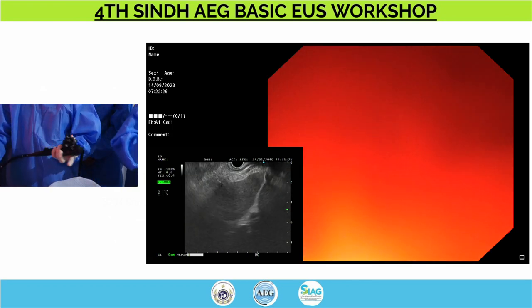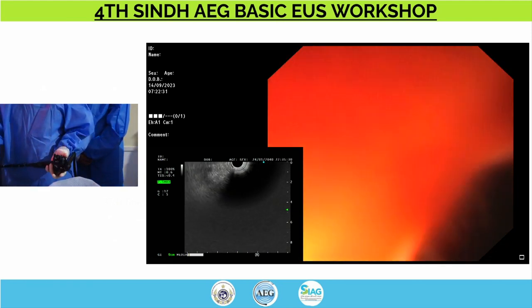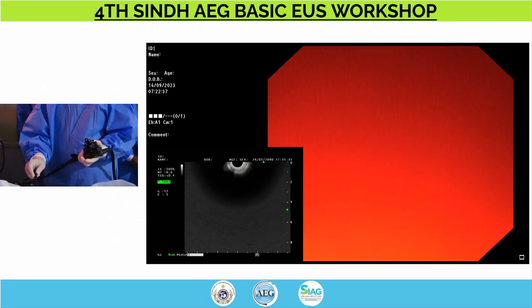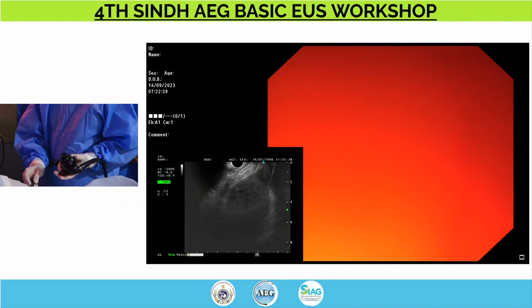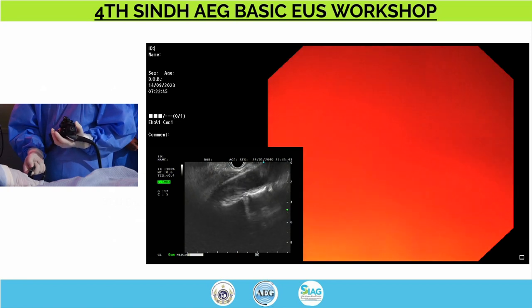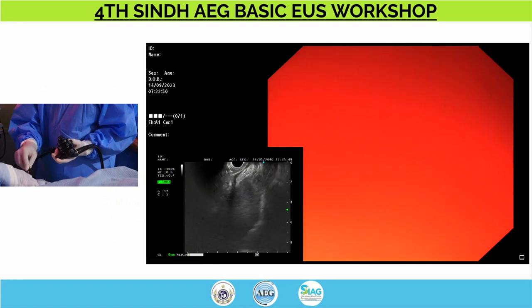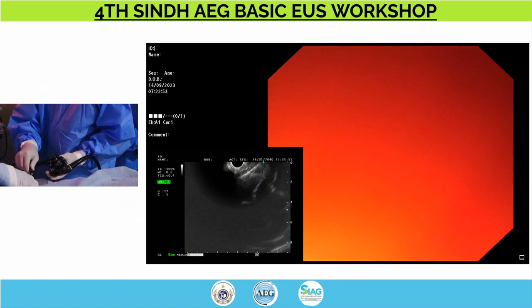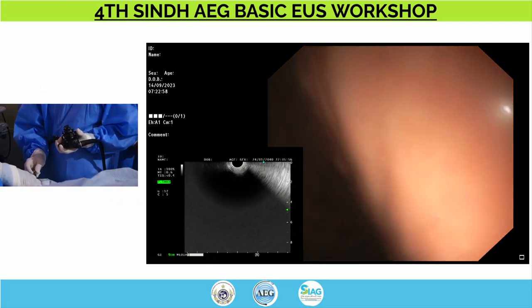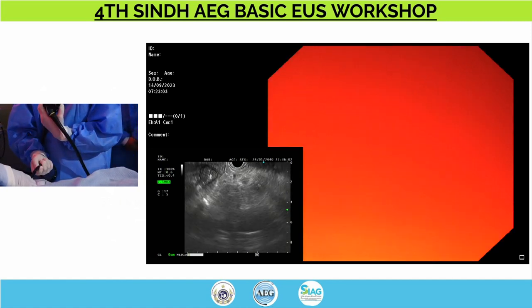So it's interesting. We're looking at this area that appears somewhat indurated, and this is just below the EG junction, and it doesn't appear to be corresponding to a mass-like lesion on the other side. Here we are looking at the liver. I'm moving all the way to the aorta here. And we're going to take a 360 degree turn just to make sure that we're not missing anything. That's the heart. We're going to go down slightly. This is the pancreas.